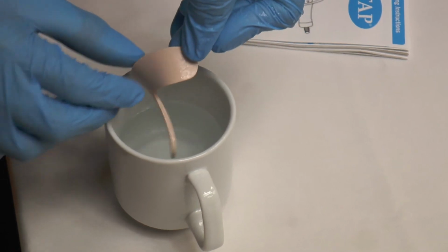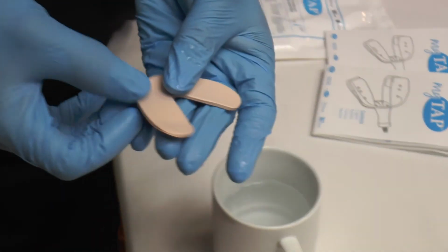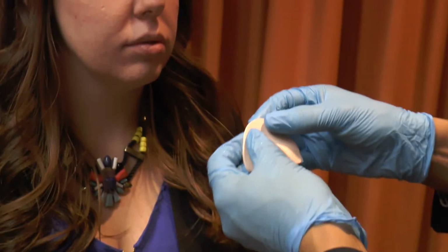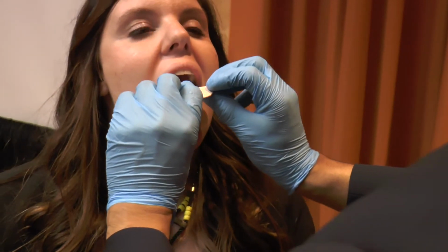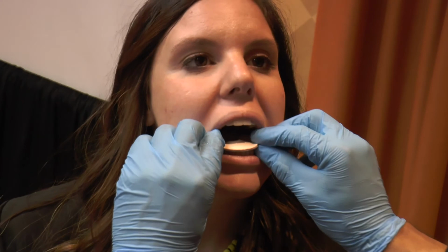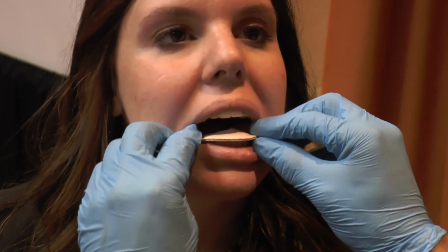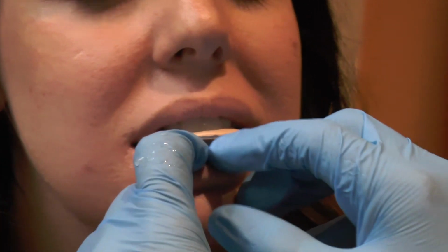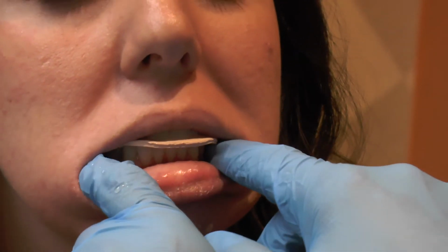Once you see it soften up, what you're basically going to do is take this to your patient's mouth, have them open, and the intention is to get a centric occlusion bite. So you're not protruding the jaw, you're just placing it over the teeth and having them bite down to the natural bite.